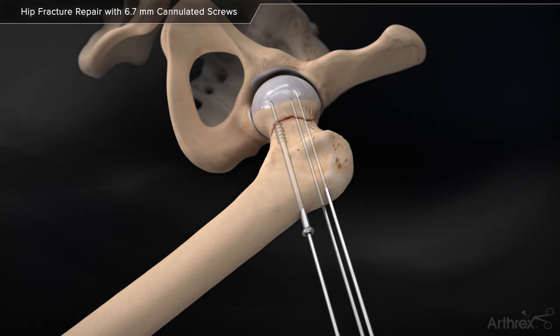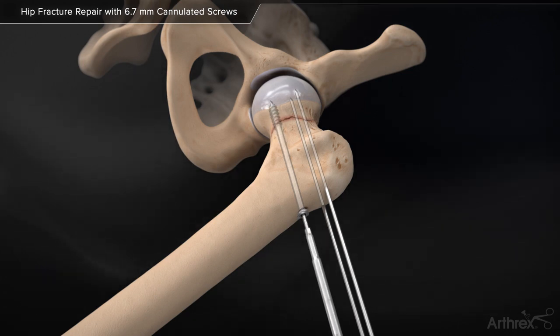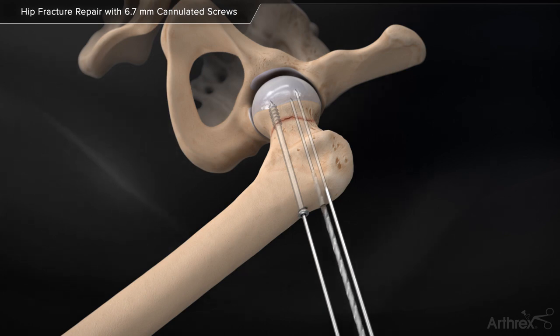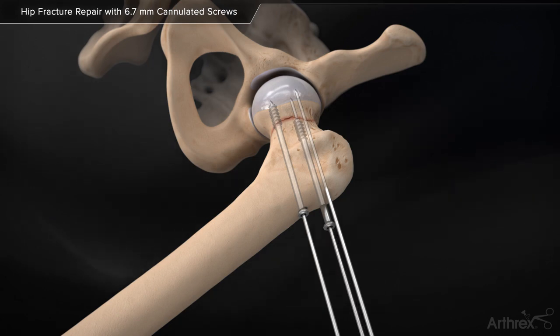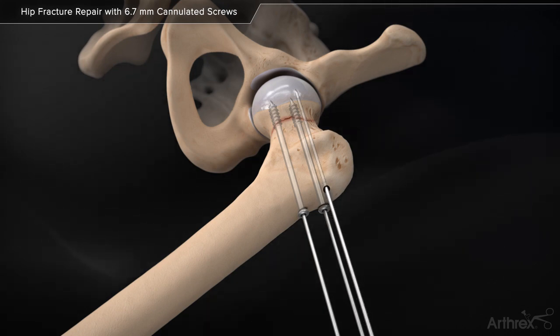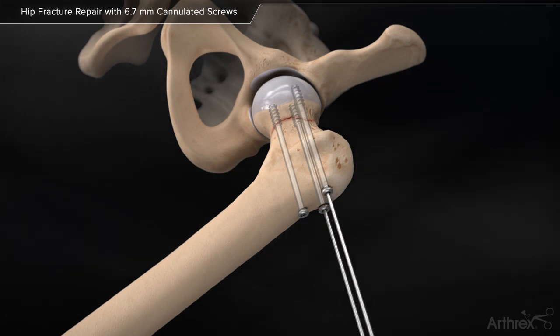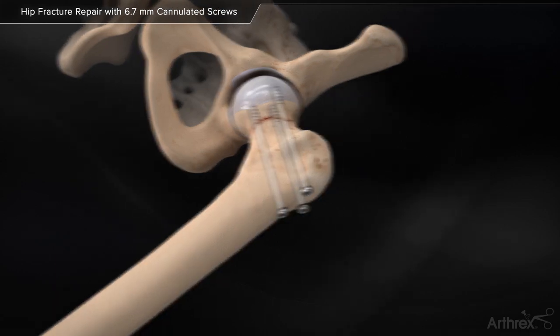Insert the 6.7mm cannulated screw over the guide pin with power using the cannulated hex driver, or manually with the cannulated hex screwdriver. Use the cannulated hex screwdriver for final seating of the screw. Fixation complete.